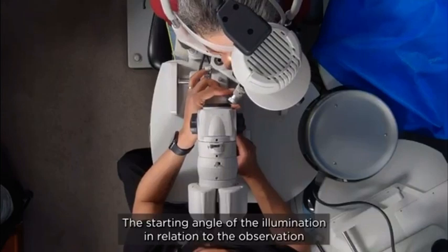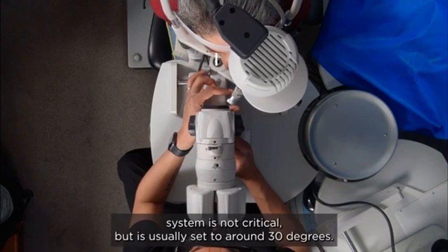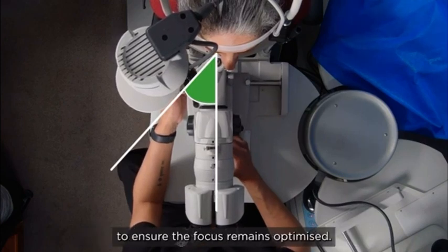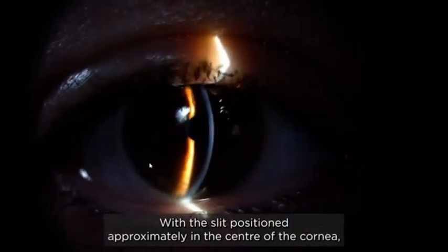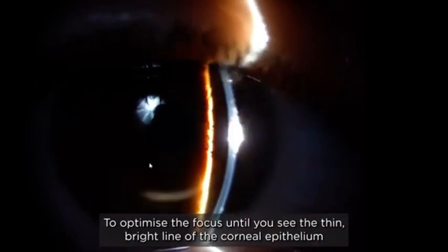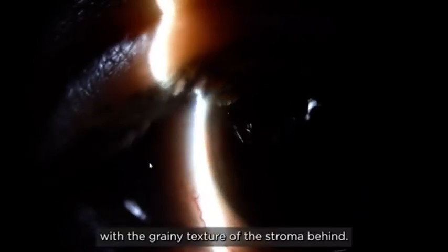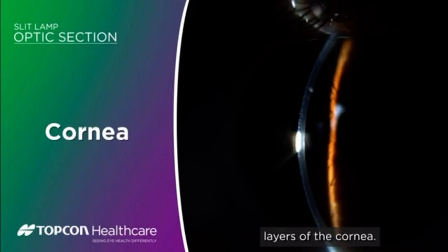The starting angle of the illumination in relation to the observation system is not critical, but is usually set to around 30 degrees. It will constantly vary as you scan across the cornea to ensure the focus remains optimized. With the slit positioned approximately in the center of the cornea, move the slit lamp in and out using the joystick to optimize the focus until you see the thin, bright line of the corneal epithelium with the grainy texture of the stroma behind. When perfectly focused, you can see the main layers of the cornea.